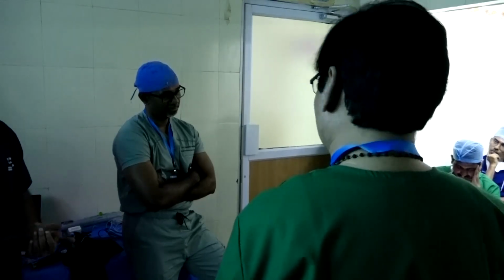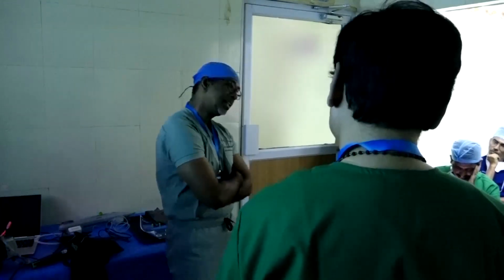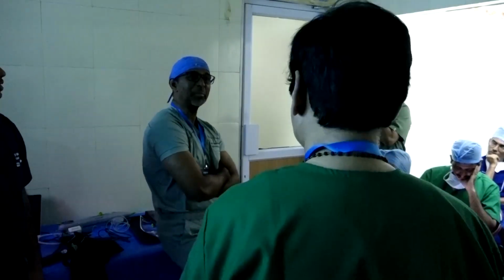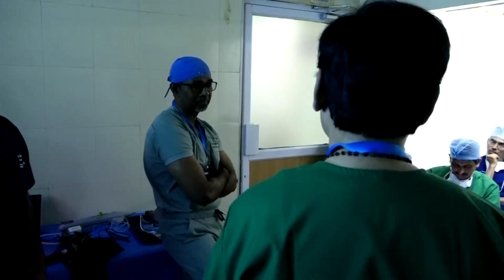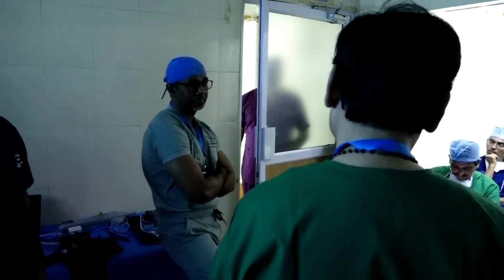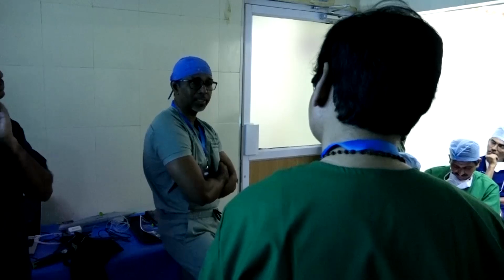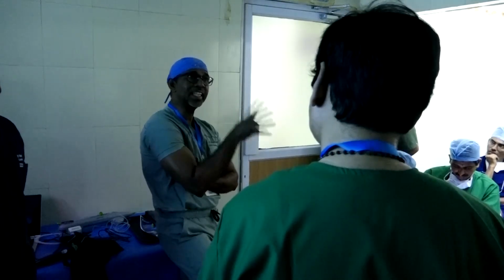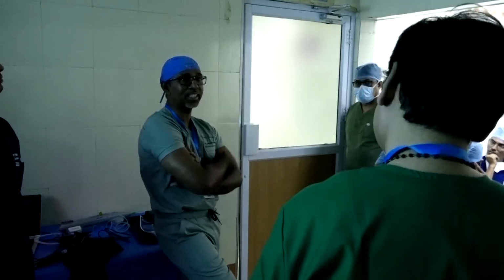That's why sick patients will be like this. Lasers are limited, you are correct, because in heavy calcific lesions lasers are out. Only mild to moderate lesions will work. For soft lesions it is very useful, and for thrombi. Yes, true. Real indication, you are correct. Absolutely.